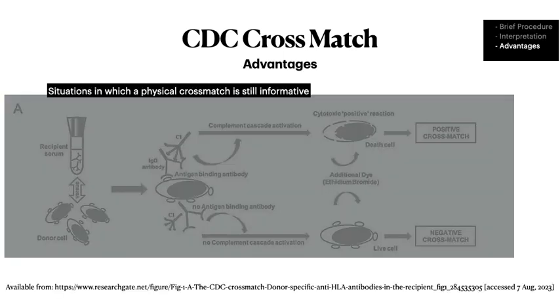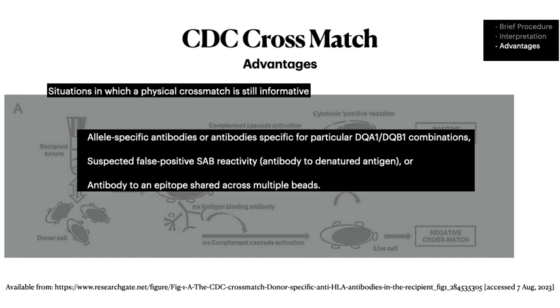So many of us must be wondering, is CDC still relevant? We have advanced technologies now. Of course it is, because as you can see here, there are situations in which the physical cross match is still much more informative or complementarily informative than other tests are, in situations where there are allele specific antibodies or antibodies specific for a particular DQA1 DQB1 combination. I'll show you the next slide to explain what I'm trying to say here.